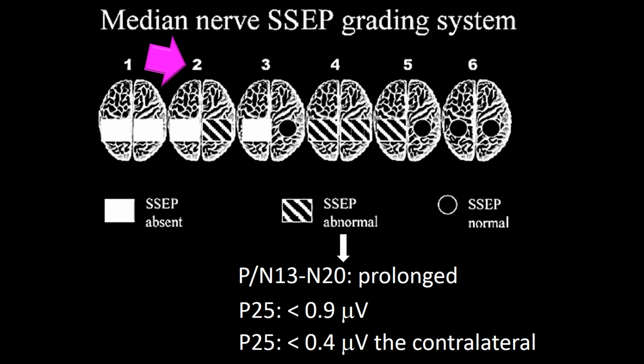So, unilateral presence of scalp potential, regardless of degree of injury, may reflect severe or mild as expressed in this frame. And certainly, if despite the absence of potential in one hemisphere, the other hemisphere is normal, the ability of using this scale for prognostication is very limited and likely to be wrong.